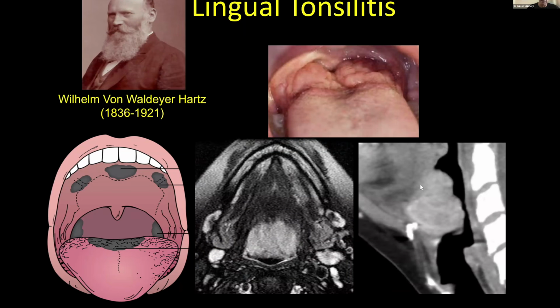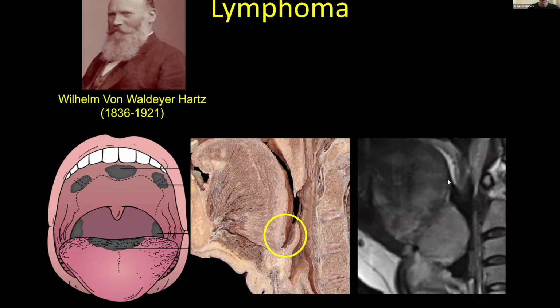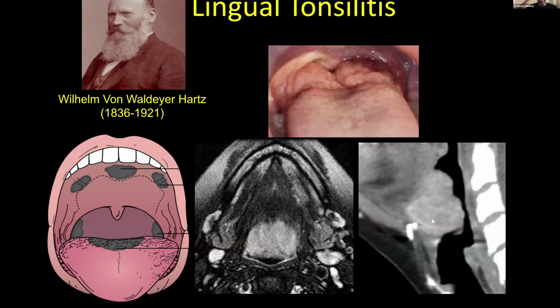And what's really challenging is that when you look at the sagittal images on the CT scan, boy, this looks a heck of a lot like what I showed before. So what do we do in these instances? Well, I see this every day. And fortunately, because I end up seeing patients on Wednesdays, I know that this is a very easy area to look and to palpate.